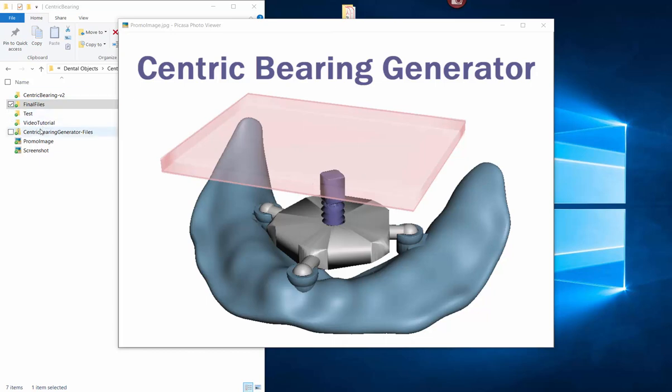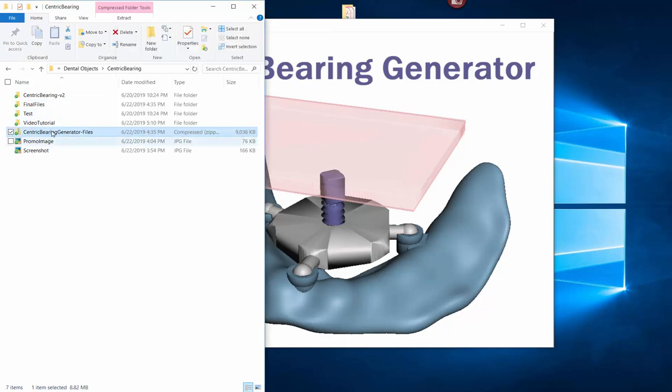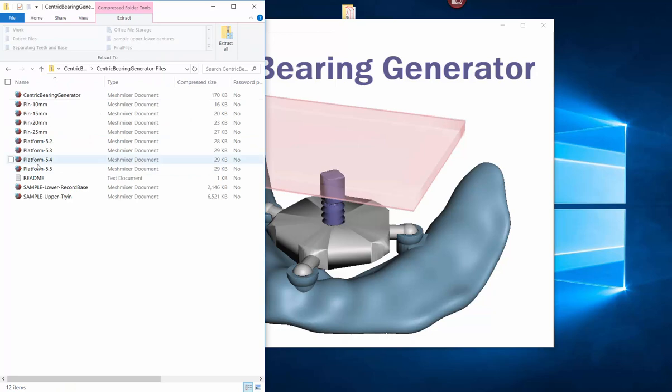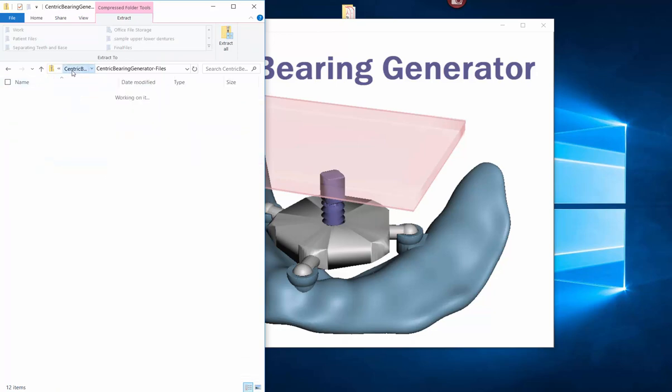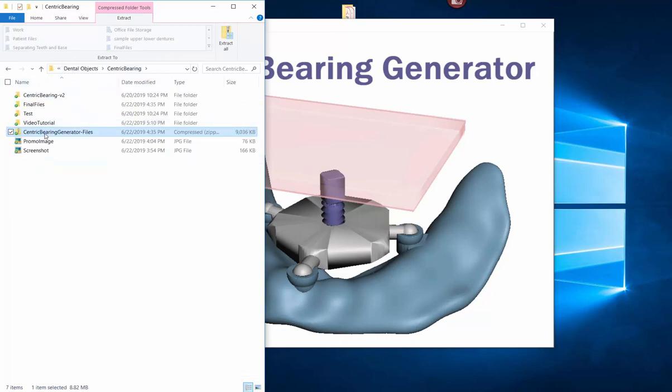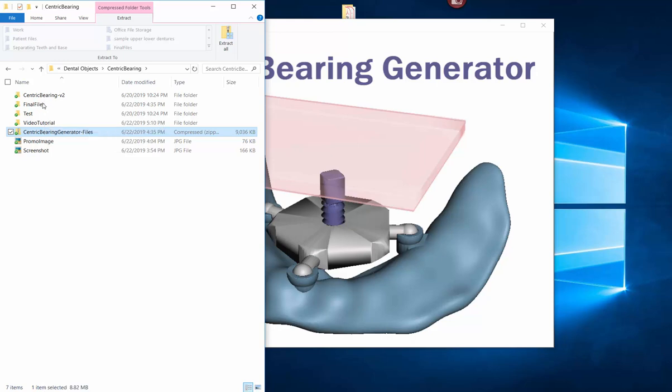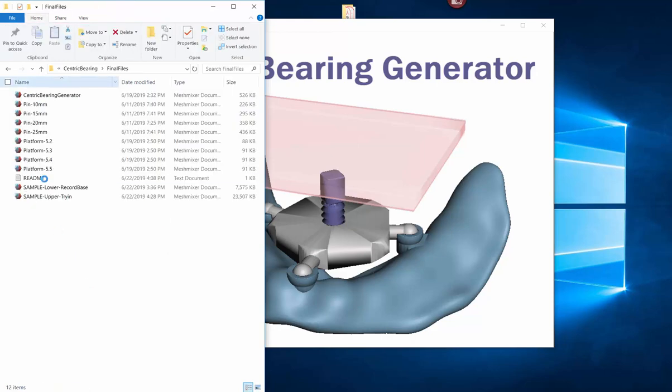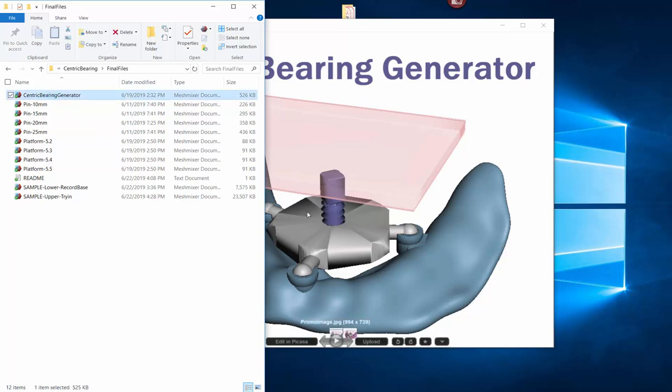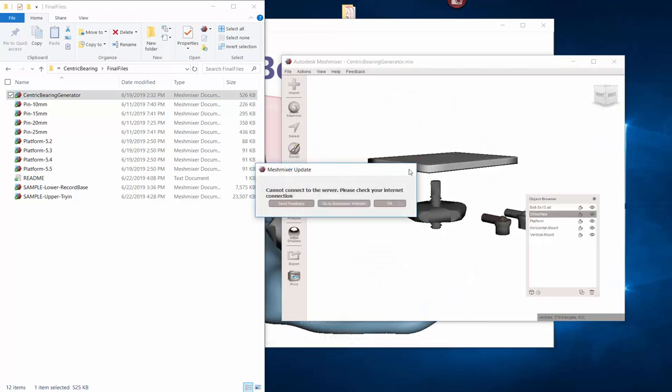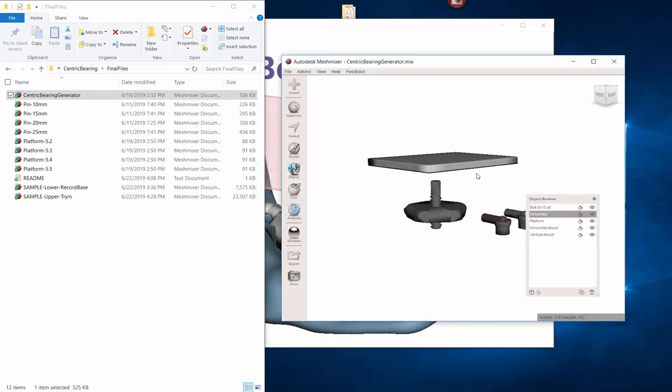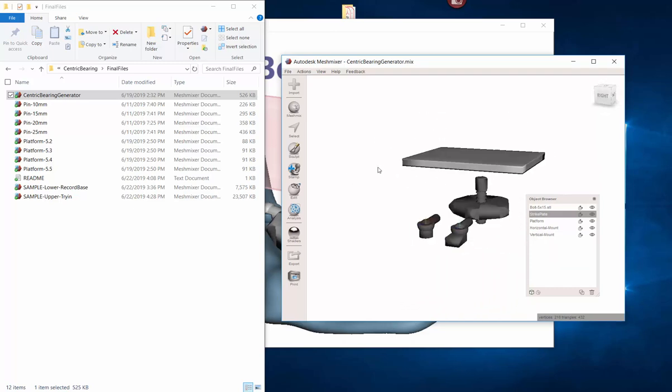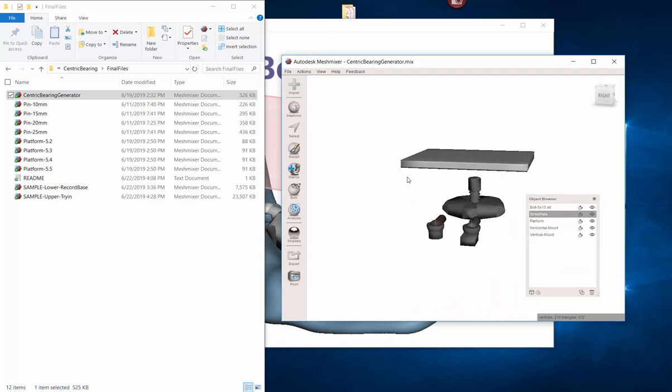When you download it you're going to get this folder right here called the Centric Bearing Generator files. It's a zipped folder. You see the little zipper right here. If you double click on it this is everything that's in it. I do suggest that you right click on it and click extract all so that all the files are natively on your computer. This is what it's going to look like. It's going to have these files right here. And to run this we actually want to click on the generator file. This is a .mix file, the file format that MeshMixer uses.